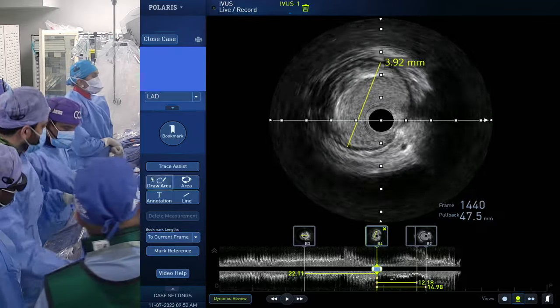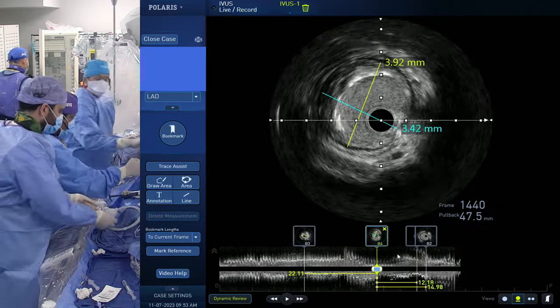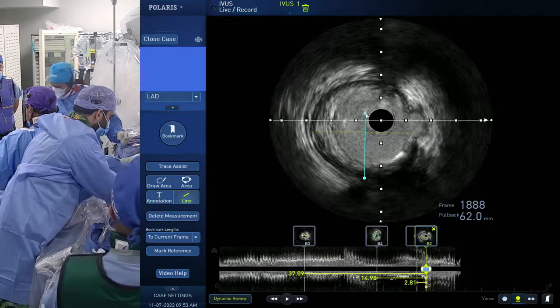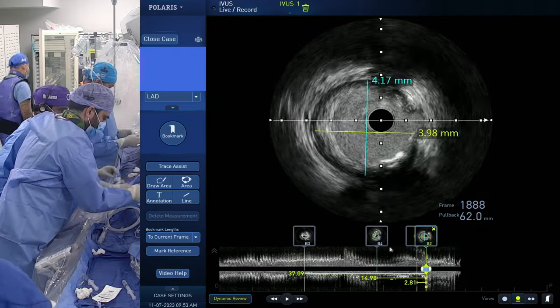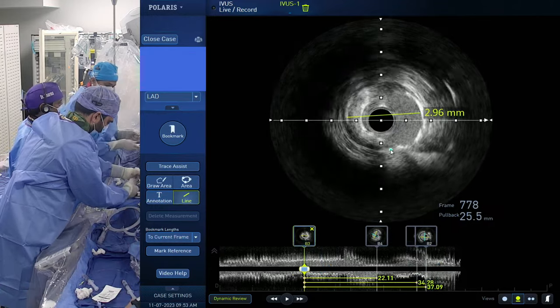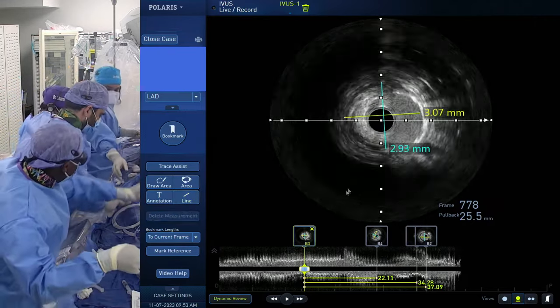Connect the IVL. Do we have a 2.5? No, 3 of IVL. No, you have a 2.5 high pressure balloon. So meanwhile, we can dilate that area. It's a 2.5 by 15. We can go 24 atmospheres in the mid to distal LAD stent aspect. You don't want to go 3.0? No, 3.0 will be too much, right? Distal vessel 2.9. Yeah, 2.75. No, 2.5 will not do it. 2.75, 3.0. Then we go 3.0 at moderate pressure. No, we have 3.0 opened. So we'll go moderate pressure. 6. Yeah, give me.